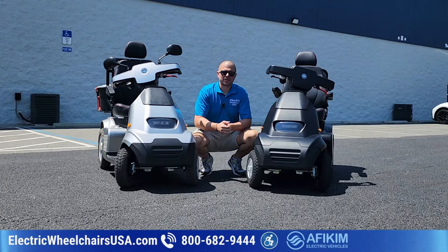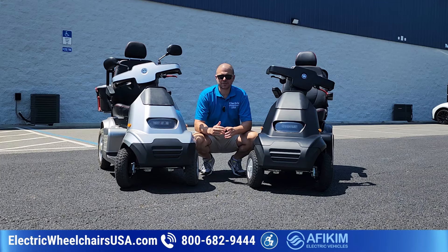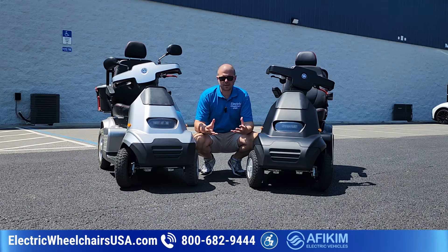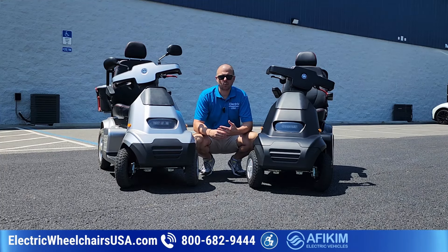Hey everyone, this is Kellen from ElectricWheelchairsUSA.com. Thanks for stopping by our YouTube channel today. In this video, we want to go over what is, in my opinion, the best heavy-duty mobility scooter in the industry. And once I go over some of the reasons why, I think you might see why I think that.